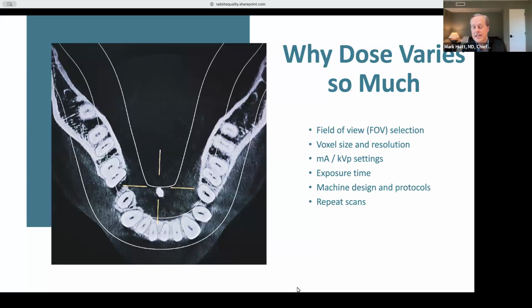That's very interesting. I've noticed myself in various dental offices that sometimes in that transition from film to digital, there comes a certain greater lackadaisical approach, maybe, to radiation, as they may think falsely that they're delivering less without the adjustment, as you mentioned, of the settings to accommodate that transition.